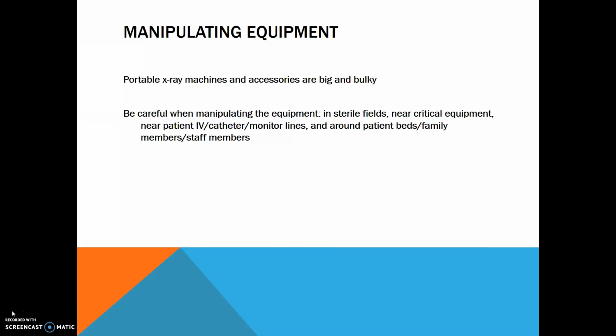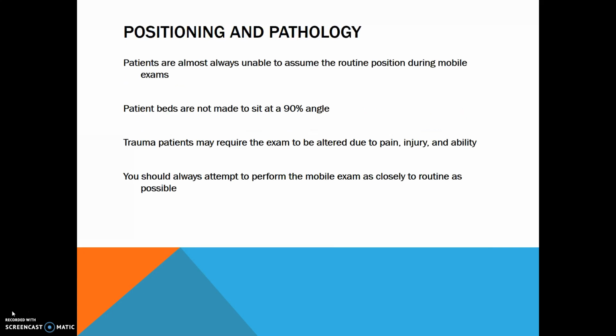Portable X-ray machines and accessories are big and bulky. Be careful when manipulating the equipment in sterile fields, near critical equipment, near patient IV, catheter, or monitor lines, and around patients' beds, family members, and staff members.